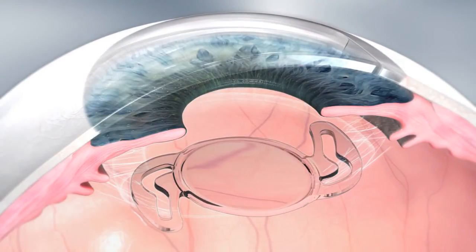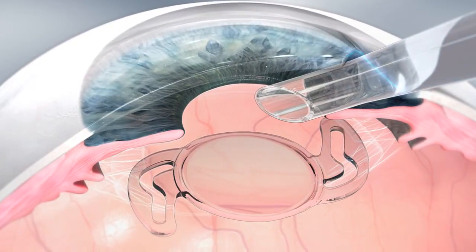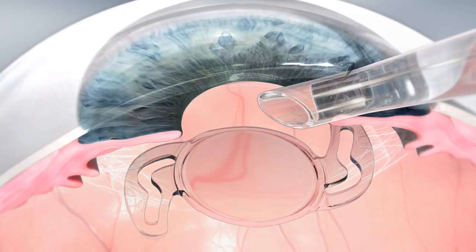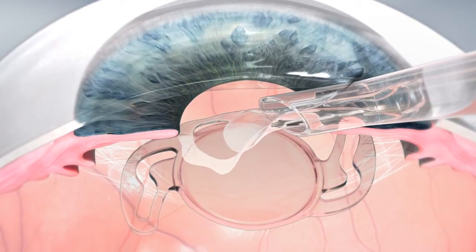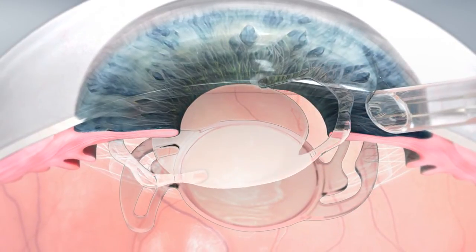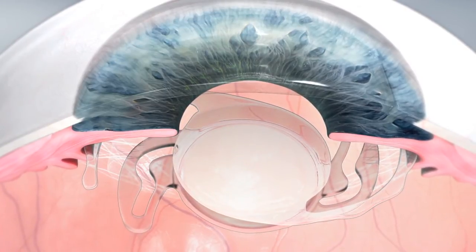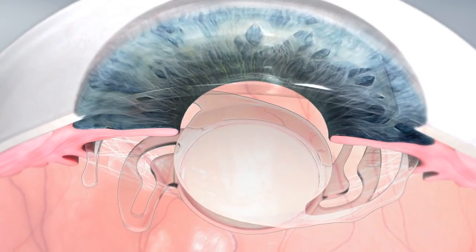Using a standard Rayner injector, a SulcoFlex lens is implanted using the same small incision technique used for the primary lens. The loading of a SulcoFlex IOL into the cartridge is no different from other hydrophilic acrylic lenses. With the nozzle in the incision, depress the plunger in a slow and controlled manner and the SulcoFlex IOL unfolds in a smooth movement into the ciliary sulcus.